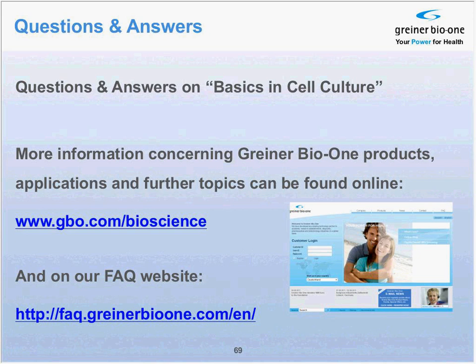I've had this when the standard penicillin streptomycin just didn't work, and then after another cure with gentamicin, the contamination was gone. Also, you have to be aware of the specificity of your antibiotic. Some antibiotics only go for gram-positive or gram-negative bacteria, if it is a bacterial contamination. So you also have to be aware of what the antibiotic actually targets.